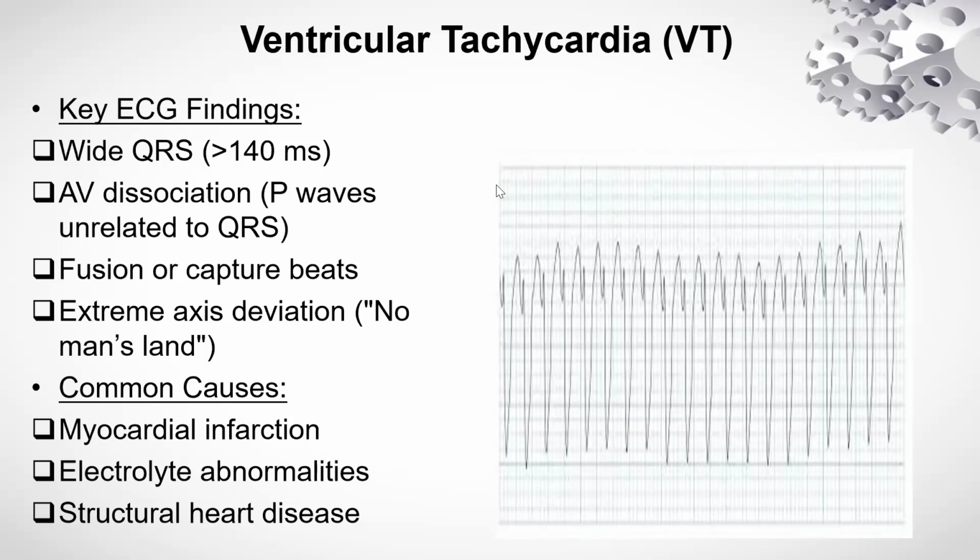This is what is known as the no man's land, ventricular tachycardia. And the good thing about it is that it shows a shockable rhythm. So when you see a ventricular tachycardia, you can shock the patient and revert the patient to a sinus rhythm.